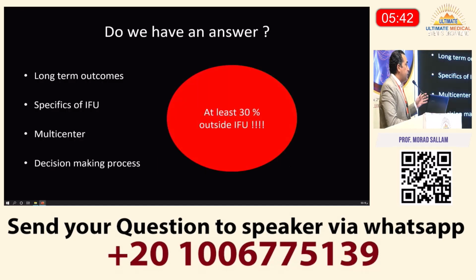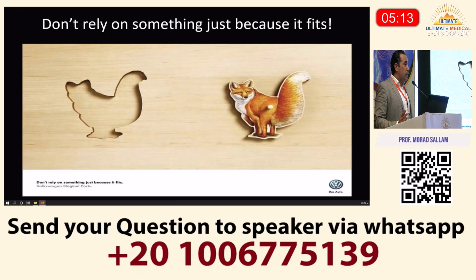Years down the line, last year at PAVSS, I presented a debate on whether we should stick to IFU or not. I have to say, I couldn't find a very definitive answer, and tried to stay balanced. But what I found in the literature is that at least 30% of the current abdominal EVARs implanted and published in the literature are outside IFU. This is a shocking number, quite a big one. The debate will carry on until we have better data. But generally speaking, I wouldn't recommend that we use devices outside IFU. They are made for a reason. It is safer to comply with the manufacturer's advice, and just because it fits doesn't mean it will work well.